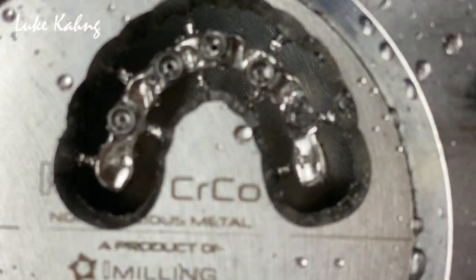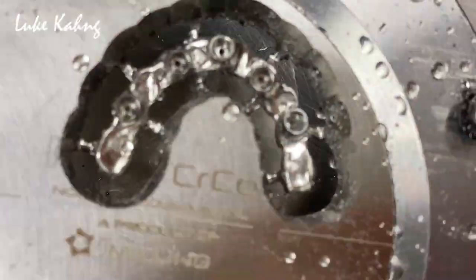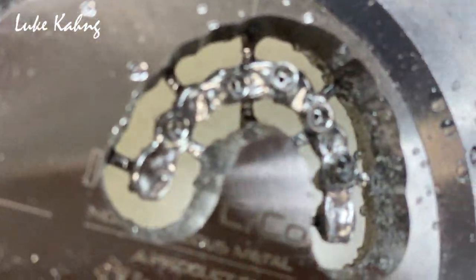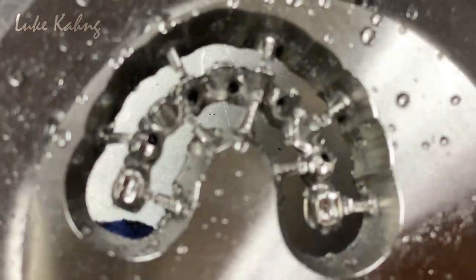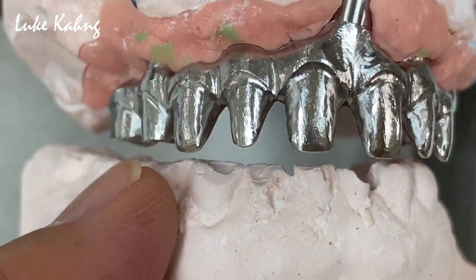I just came out from the D-tron D5. The re-mill with the chrome cobalt. We focus on more pontic area. This is the model. Now it's ready to cut. Okay, so this is a chrome cobalt.